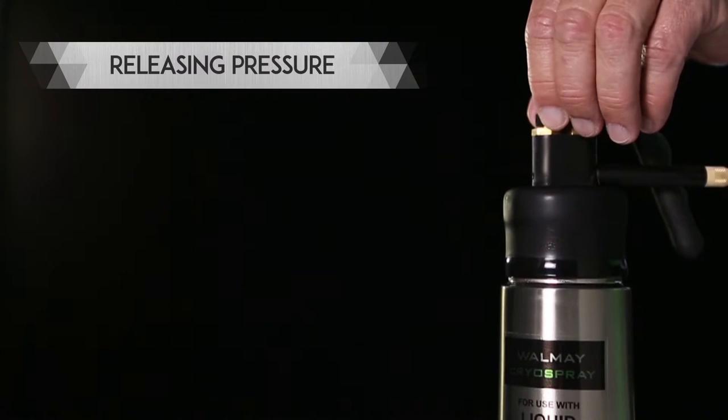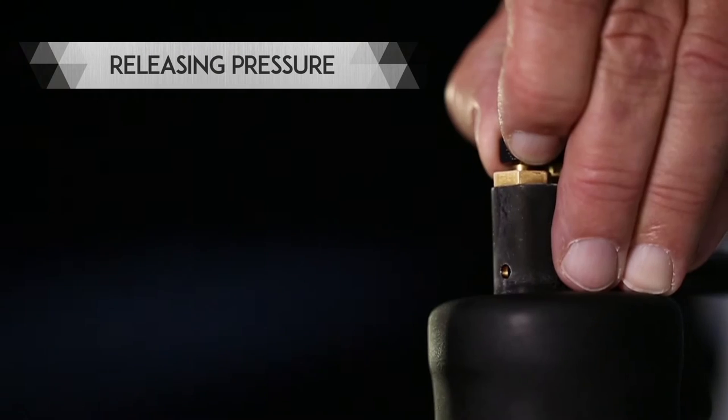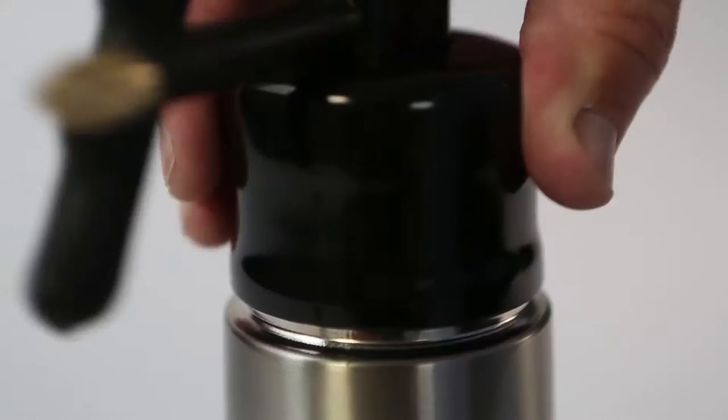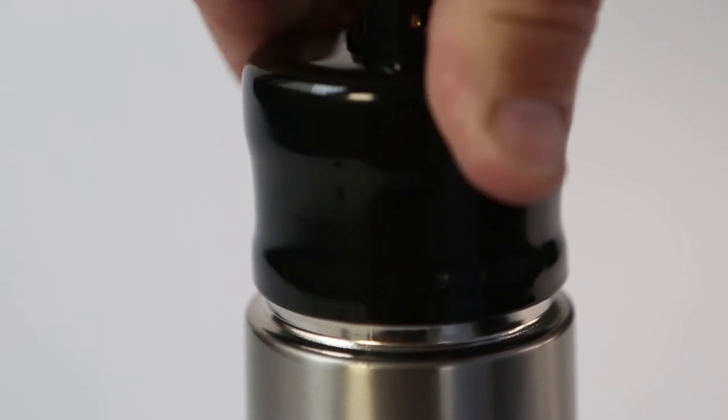Raise the knurled brass safety valve to release internal pressure, taking care to keep your hand away from the safety vent. The turret may then be unscrewed and the flask refilled.